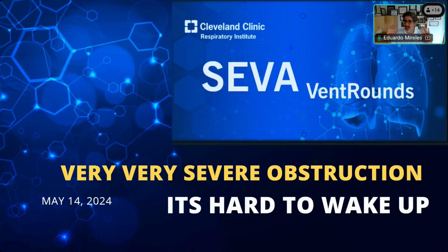This is probably one of the coolest cases that I have seen in a while because it has so much to teach. So we're going to take some time on it, and I hope that you enjoy it as much as I did, and I continue to see this. This is an evolving case, so we will learn together. The case is very, very severe obstruction, and it's very hard to wake up.